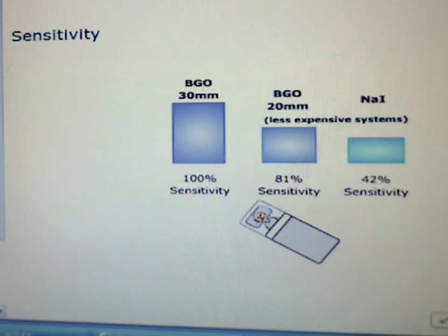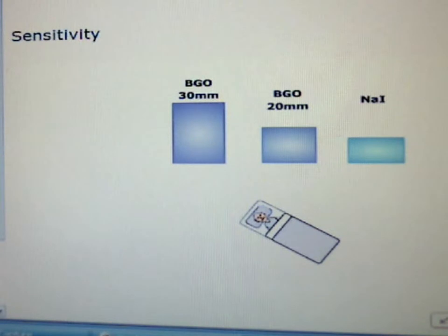These percentages do not reflect the increased scatter resulting from more rejected events by lower density or less deep crystals. The type and thickness of the crystals are of utmost importance in system sensitivity and the resultant whole body resolution. Since the lack of sensitivity can only be compensated for by longer acquisition times, any resolution gain will be lost to patient motion.